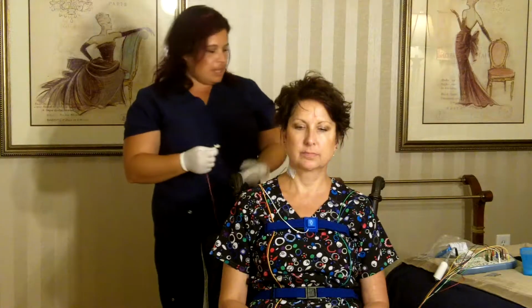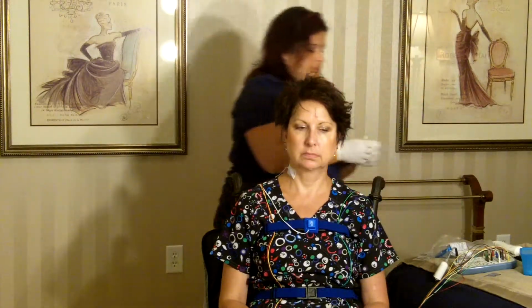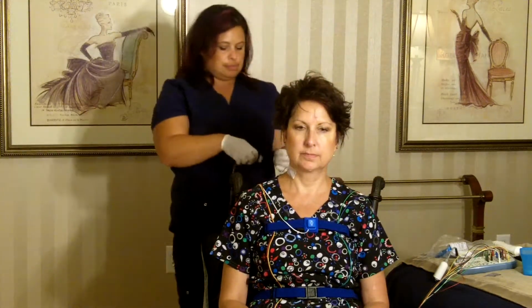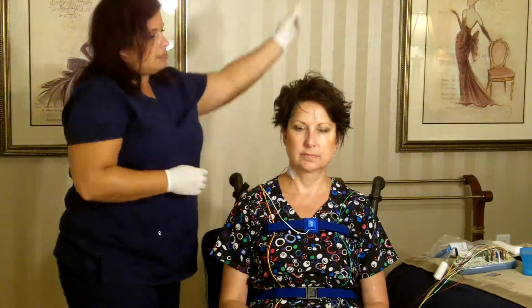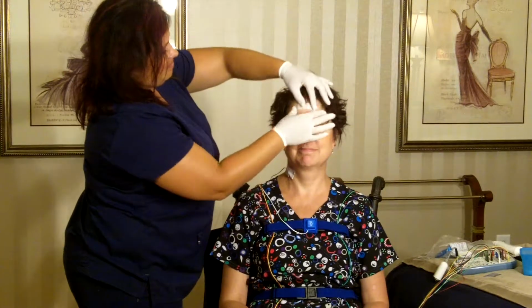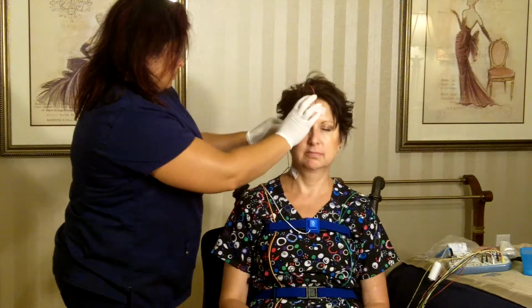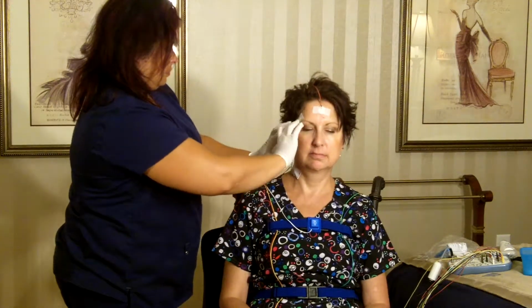The rest of the wires that Mindy will be applying are secured with a washable paste and hypoallergenic tape. These are both safe for skin and will make sure that the wires don't fall off during your sleep study, which is essential for returning the best results. Several wires will be placed on Kayla's head, starting with her forehead. These allow Mindy to monitor brain waves, which helps her determine what stage of sleep Kayla is in.